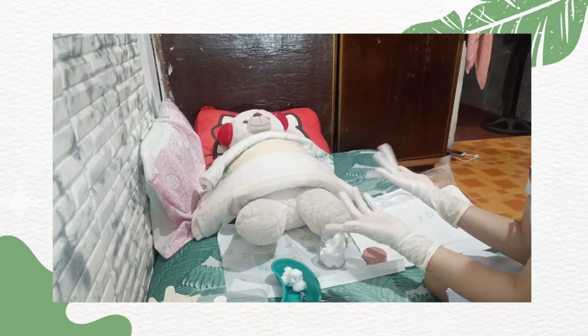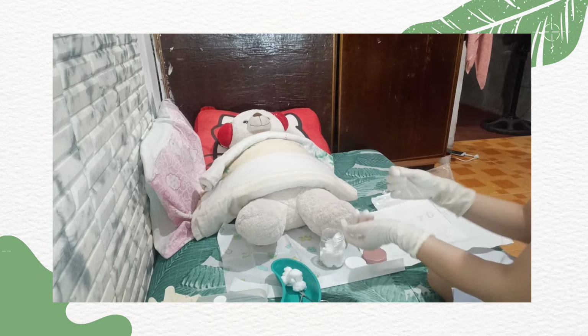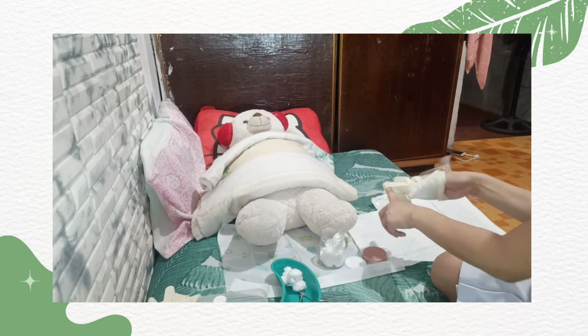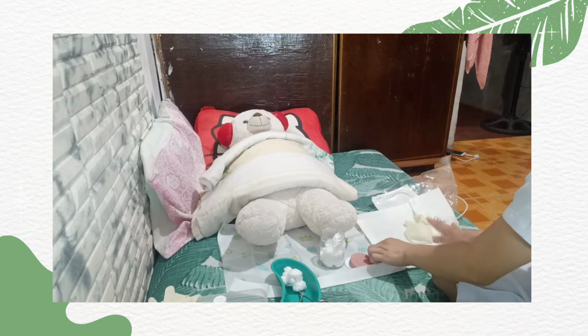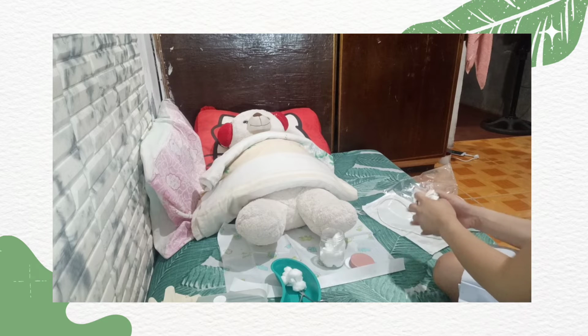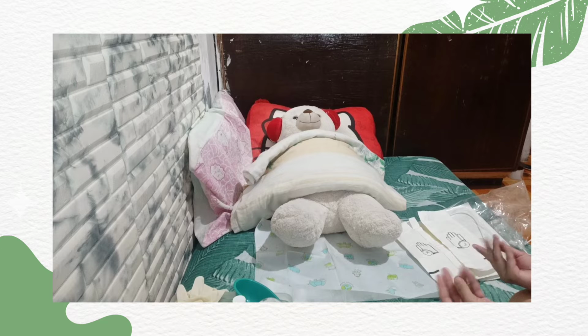Next, we need to remove our sterile gloves because they are now contaminated, and then we need to discard them. Next, we need to wear new sterile gloves.